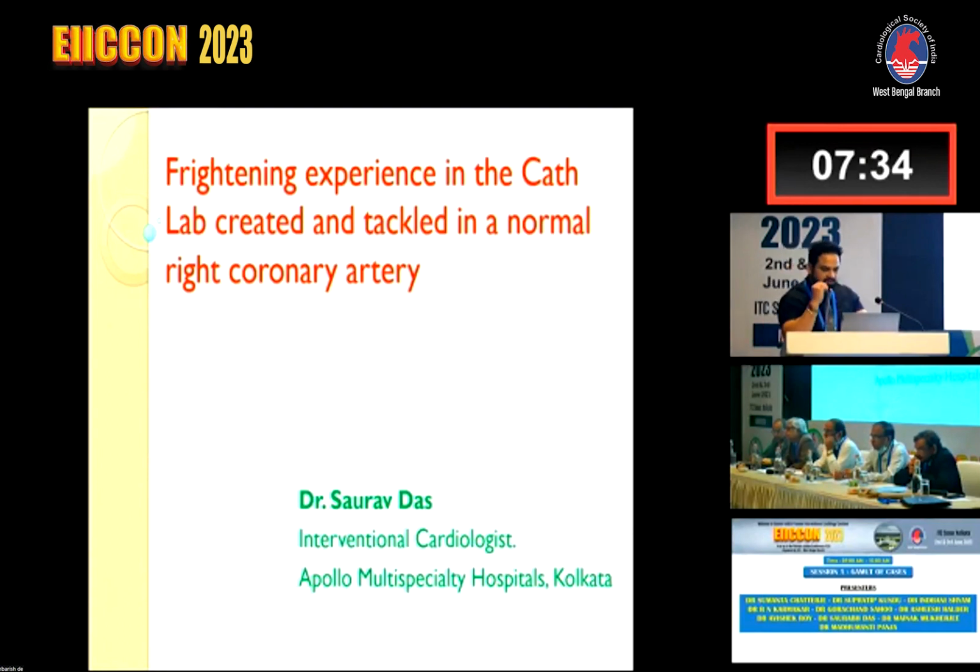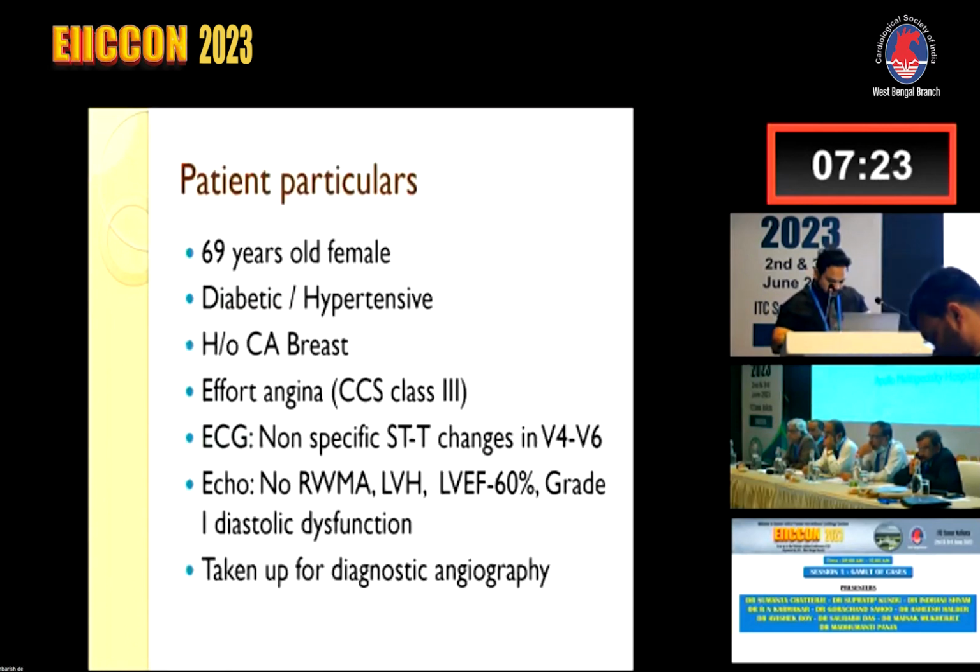I have given the heading: it was a frightening experience in the Cath Lab, which was created and tackled in a normal coronary artery. To start with, this was a 69-year-old female, diabetic and hypertensive, with a history of CA breast.